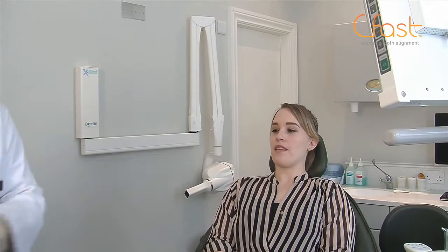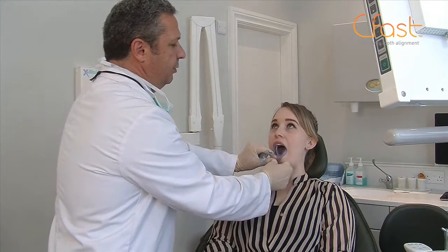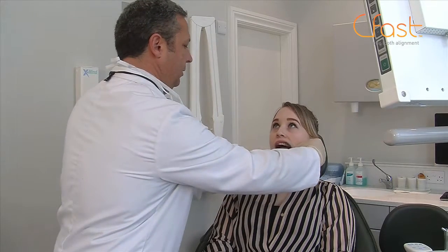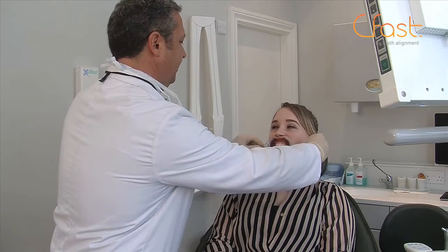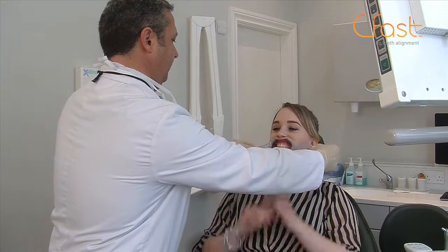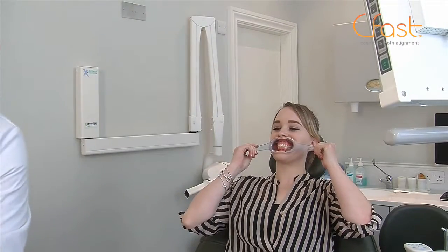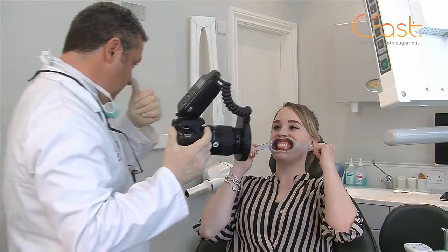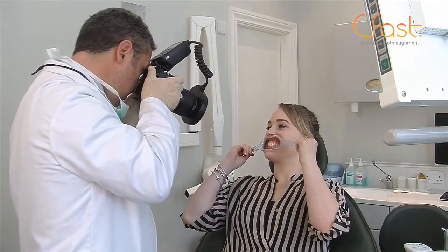And for this, we're going to have our cheek retractors. So we're going to just rotate this in. So if we put that there and just roll it round, similarly here, roll it round. Okay, now bite your teeth together for me now, Heather. So Heather, I'm going to ask you to hold these for me and pull them apart. That's it. Okay. So again, get yourself in a comfortable position. So Heather, can I ask you to move your head to the right? That's it. And we're going to take teeth together first of all.